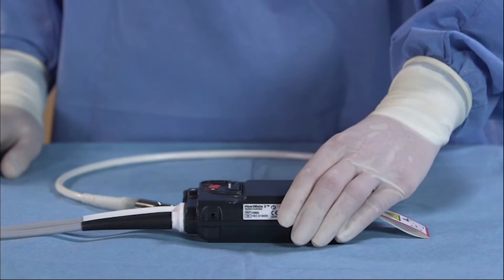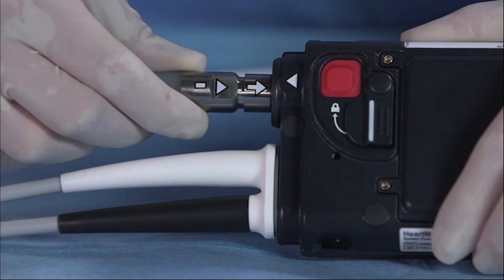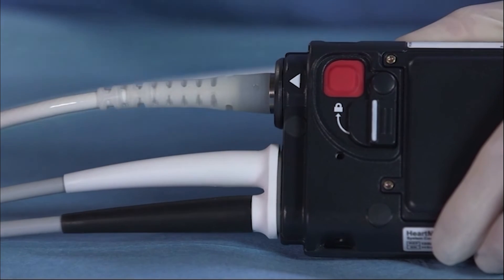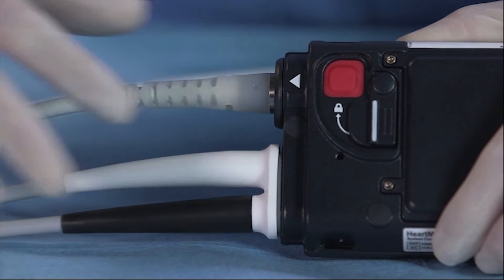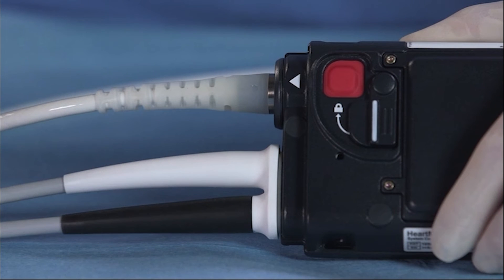To connect the modular cable to the system controller, line up the arrows and insert the cable into the socket until it clicks into place. Gently tug on the end of the connector to ensure the cable is fully engaged. The arrow and alignment mark on the modular cable will no longer be visible when the cable is properly connected.